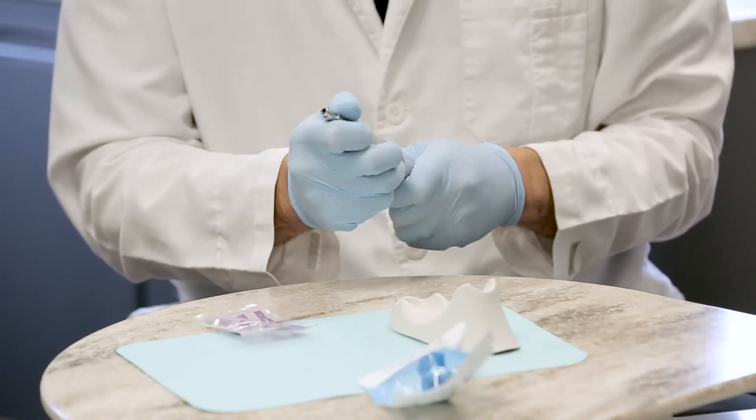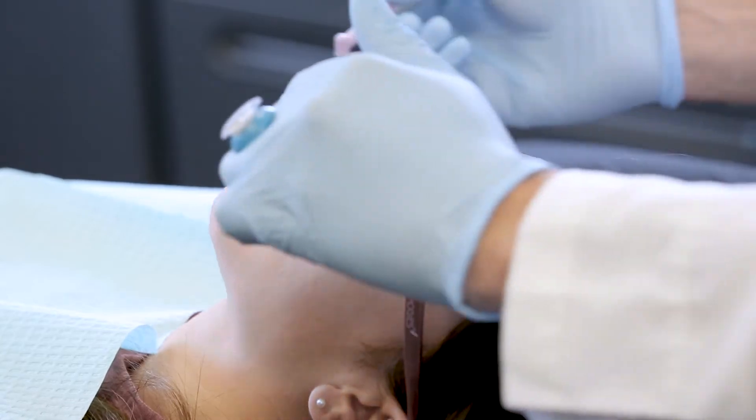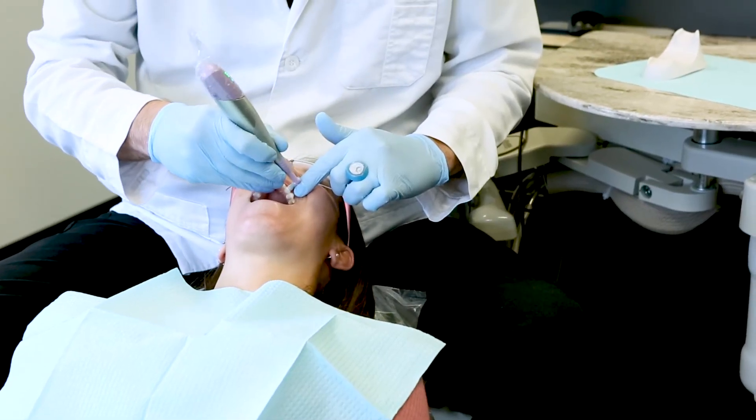Handpieces with the cord had a lot of weight to them. You're always trying to grab the cord with your pinky to get the weight off. With the old corded handpieces I was at times sore with my wrist. I have some tendon problems as it is already, so I get a little bit more fatigue, but with the cord aside there's nothing at all.